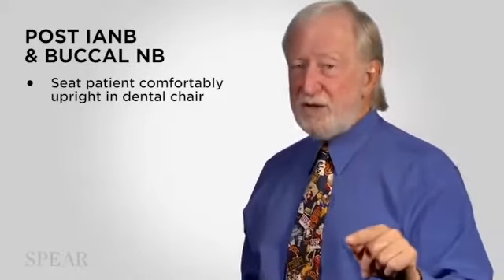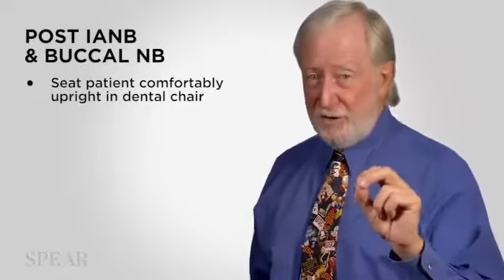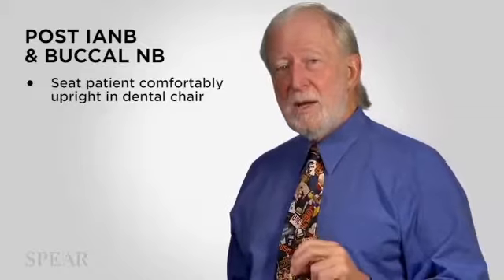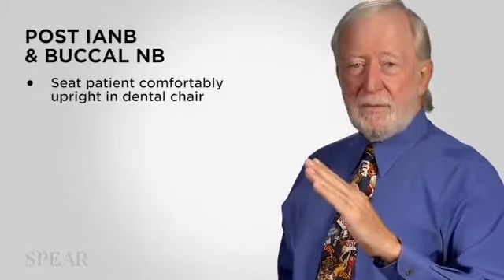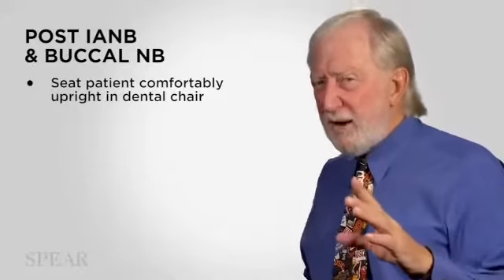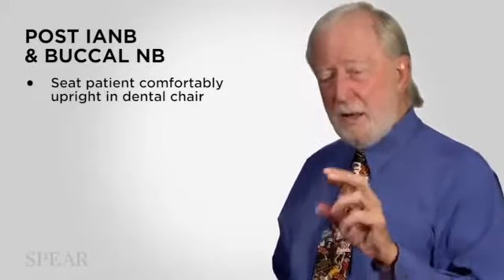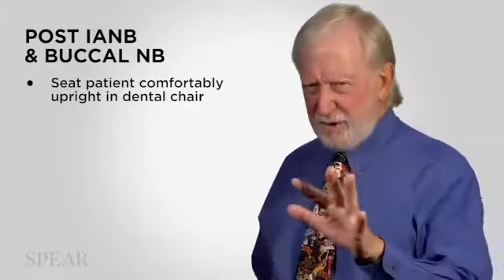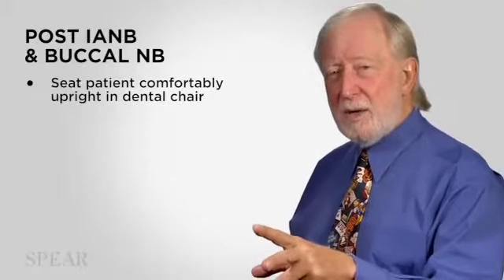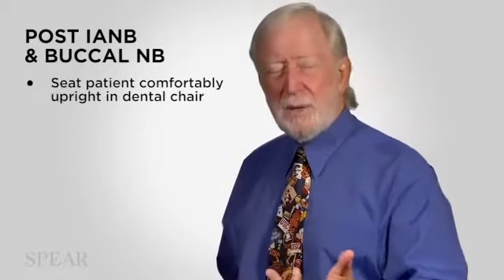So once this injection is done, or once these injections are done, the IA block and the buccal injection, sit the patient up comfortably. And what I have found in my experience, I can't give you a scientific reason for this, but when I get called down to that clinic at USC, and the patient has gotten 2 or 3 injections from the student, 2 or 3 from the faculty member, and it's always the mandible.